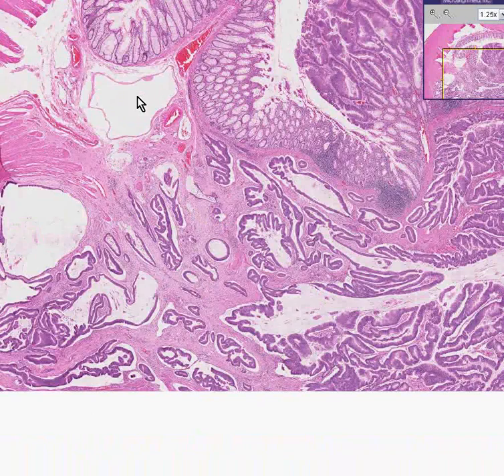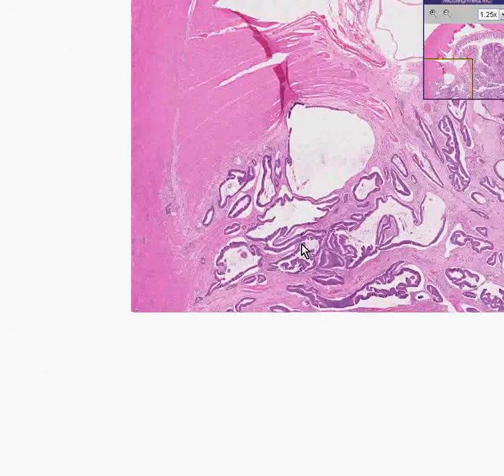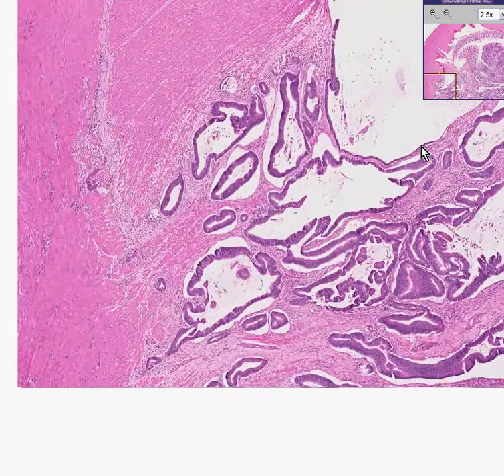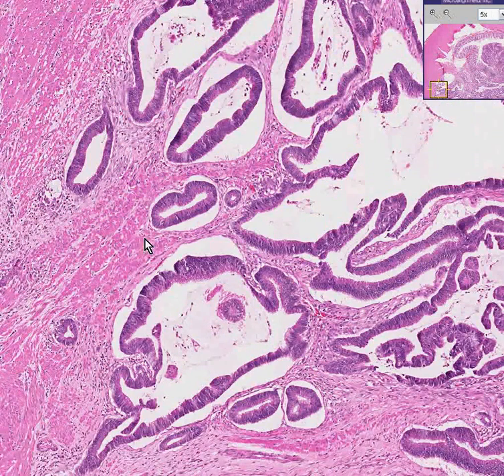All of this now, where you have all this vascular tissue, is submucosa. And in addition, we have found some glands that have even decided to invade or infiltrate themselves between smooth muscle bands as well. So here is a really good example of smooth muscle infiltration of a colon cancer.